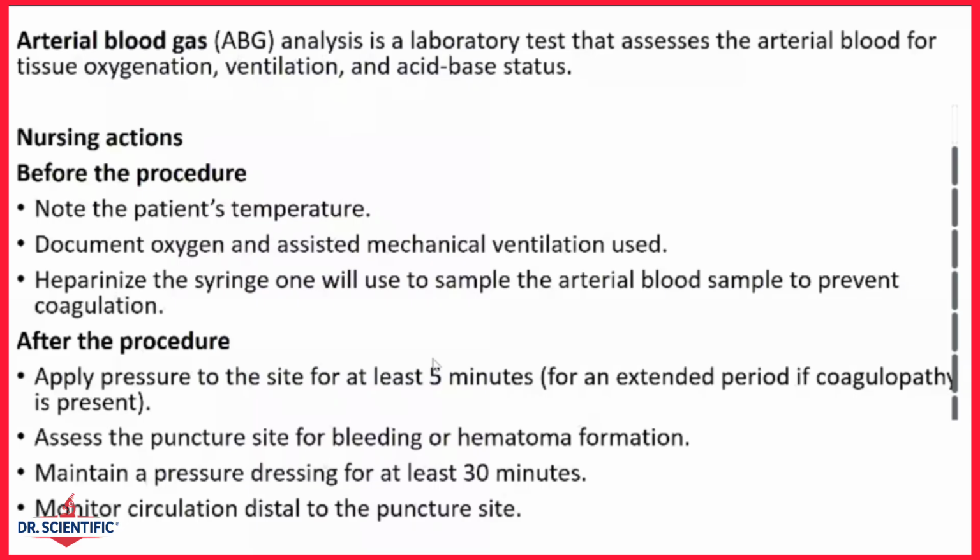After the procedure, apply pressure on the puncture site for at least 5 minutes. Assess the puncture site for bleeding. Maintain pressure dressing for about 30 minutes. Then monitor circulation distal to the puncture site, and see whether there is circulation.